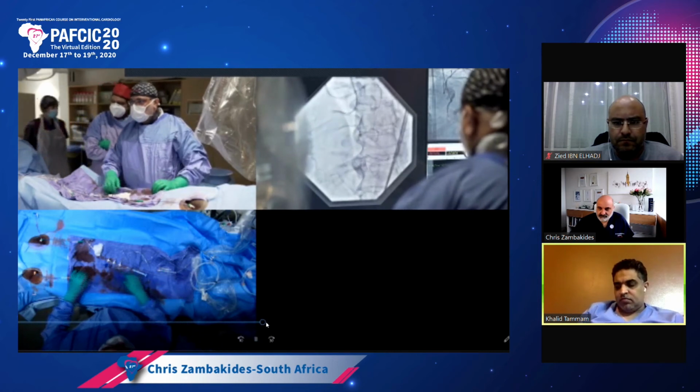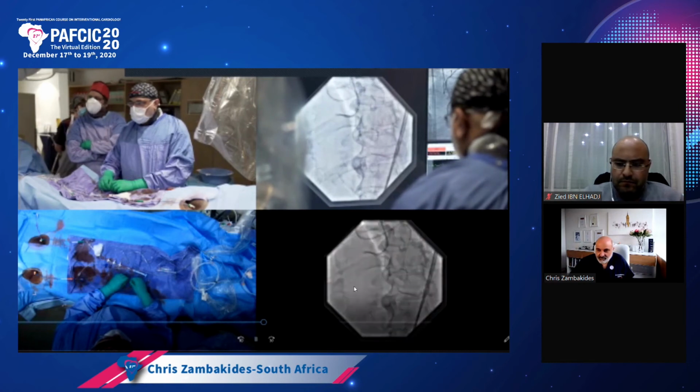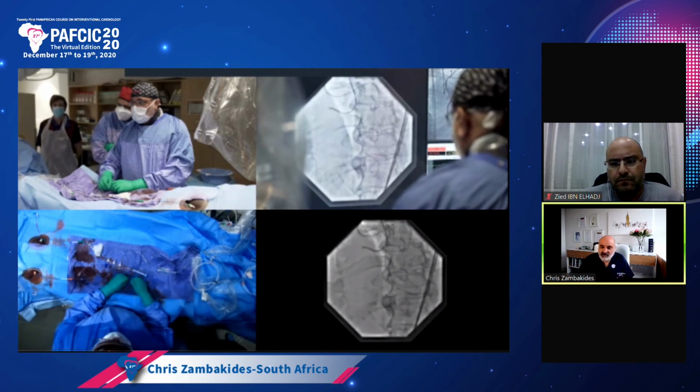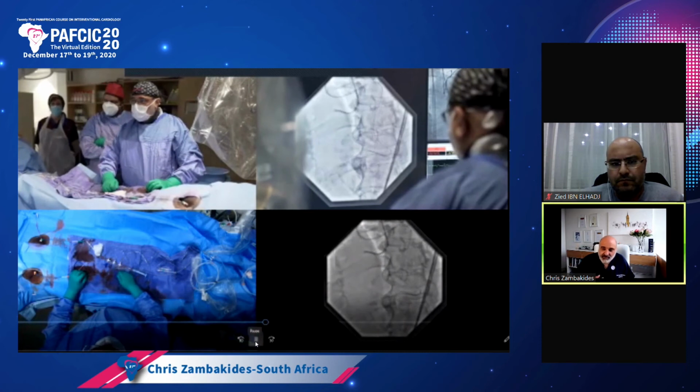Yeah, that's what I'm doing, very gently, because I don't want it to jump too far back. Yeah, that's the direction. If you have a look at the angiogram here, I know it's small, sorry about that. You can actually see the Sion Black. I wanted to get past the bifurcation and then change again to a Gaia, but you'll see that the Sion Black hooks onto the stent and actually knuckles into the stent. And then I knew that if a knuckle goes in, I must be in the true lumen. Or not true lumen, but I must be in the lumen of the stent.